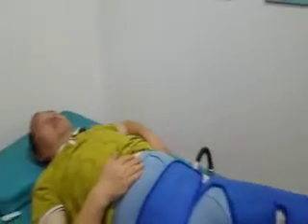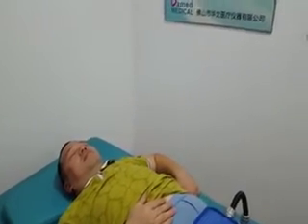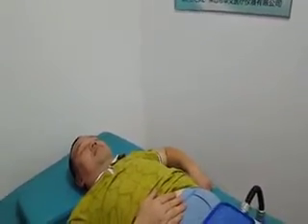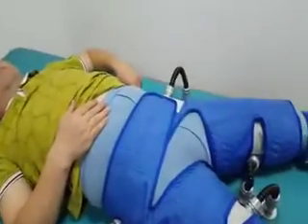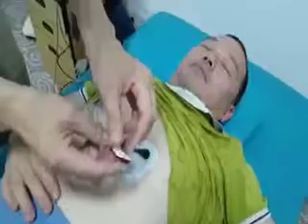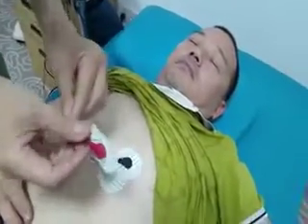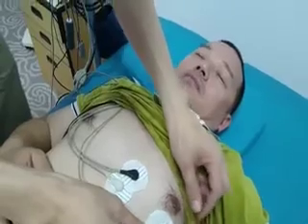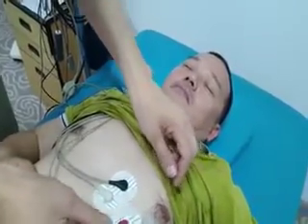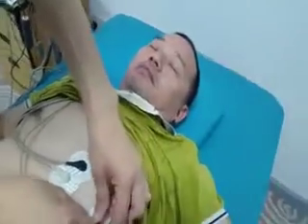The upper side cuffs: the lower edge of the center seam should be aligned with the patient's coccyx. Now let's apply the ECG electrodes to the patient. Attach the lead electrodes to the electrode cables first, and then connect them to the patient's body.